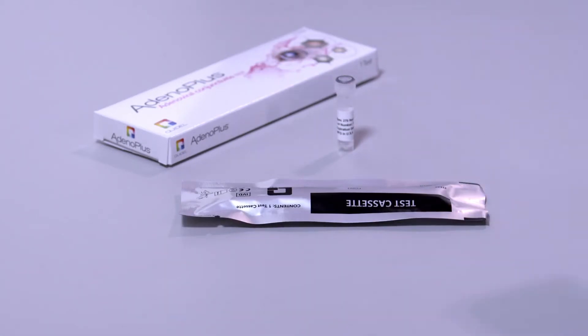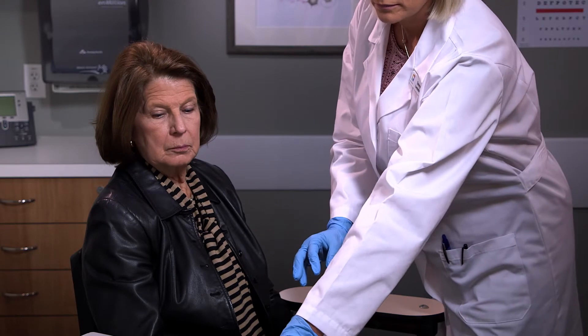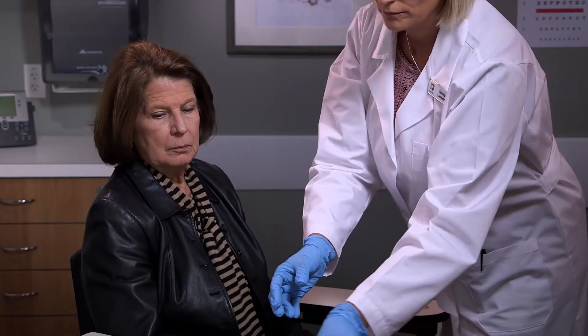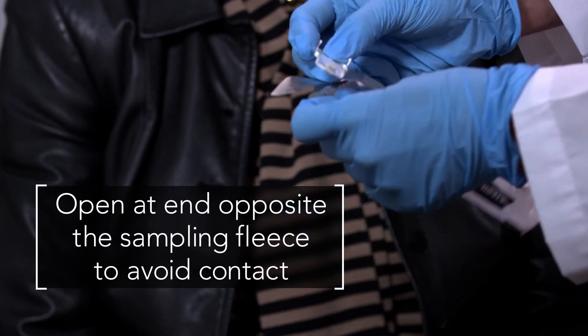To assemble the test, make sure there is no damage to the foil pouches before opening to ensure contents are still sterile. Open the test cassette and set it aside. Next, open the sterile sample collector, being careful to open at the end opposite the sampling fleece to avoid contact.